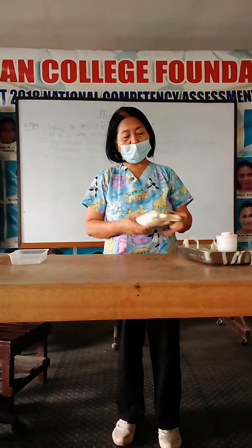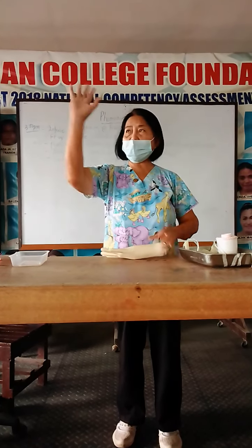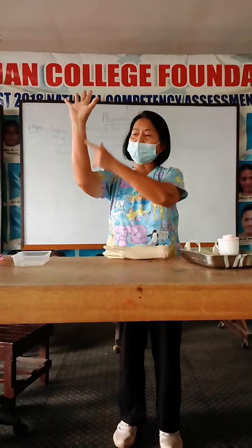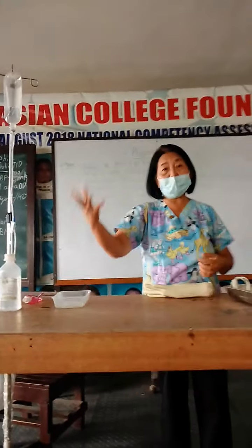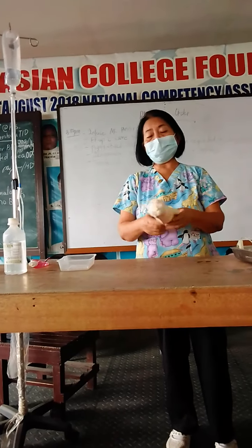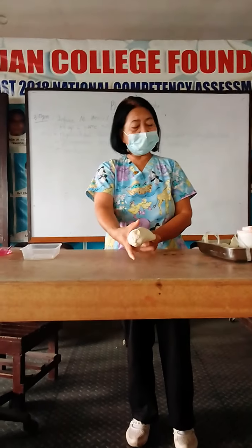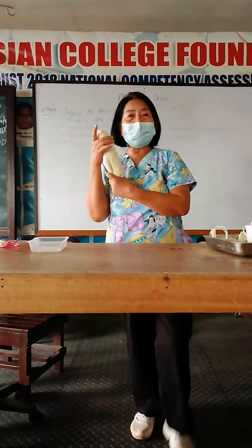So I just want to let you see that this is the metacarpal vein. And then when you turn it, metacarpal vein, here is the cephalic vein. Cephalic vein. And this is the basilic vein. There are still other veins that IV fluid can be inserted. Of course, when you insert it, the fingers should be facing you and then you hold like that. And then there's a tourniquet that you should put here.